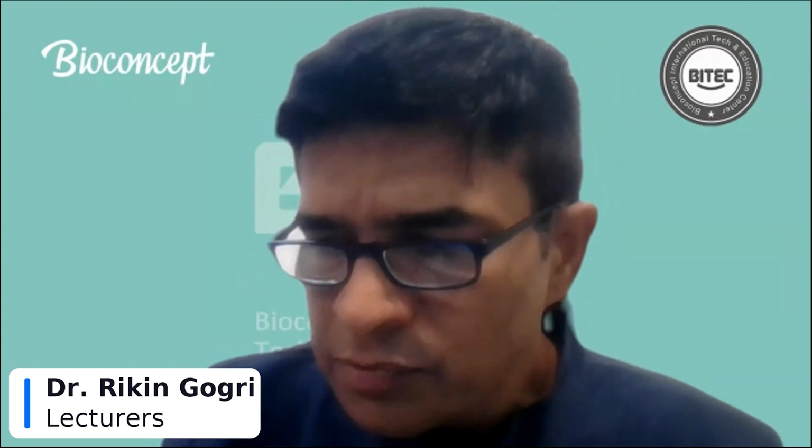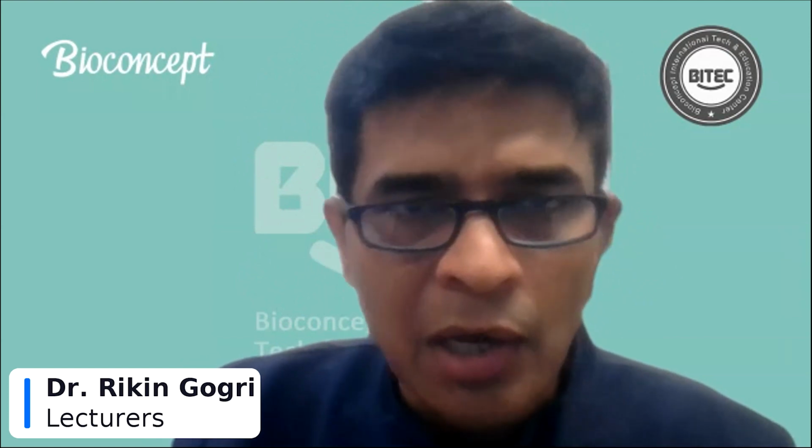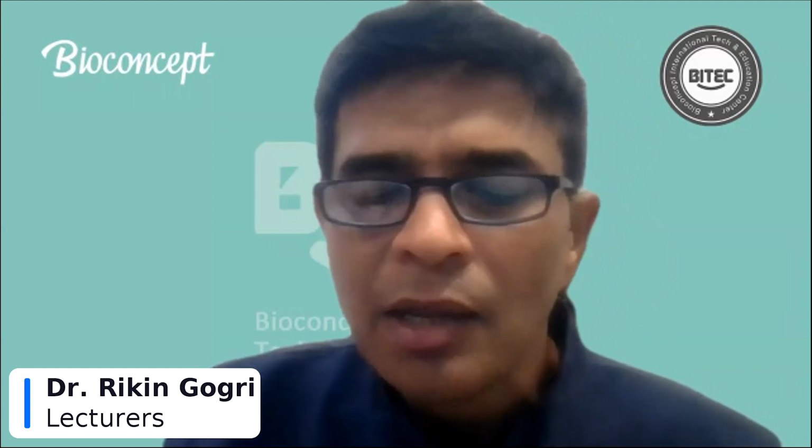The third is, for implant placement, how can we efficiently avoid areas at high risk? Again, this is what we call plan and execute. First is to understand and evaluate your case, and understand your limitations based on your surgical skill, your level of implantology that you are practicing today. If you have done a few hundred, you will probably not feel anxious about a case like that. But if you are starting off, then we would look at a lower first molar as your ideal case to begin with, where there is enough bone height and volume available.